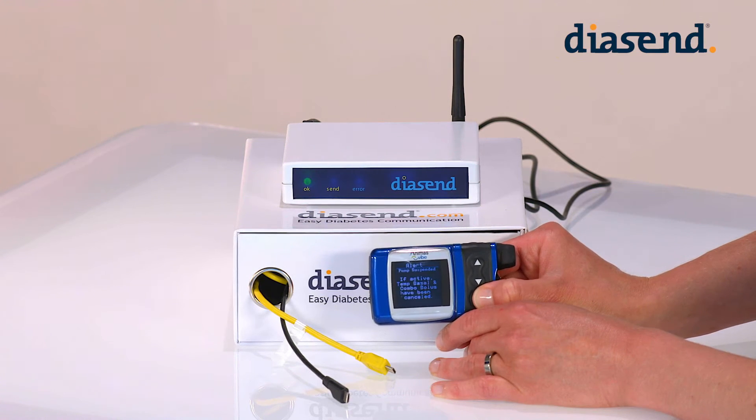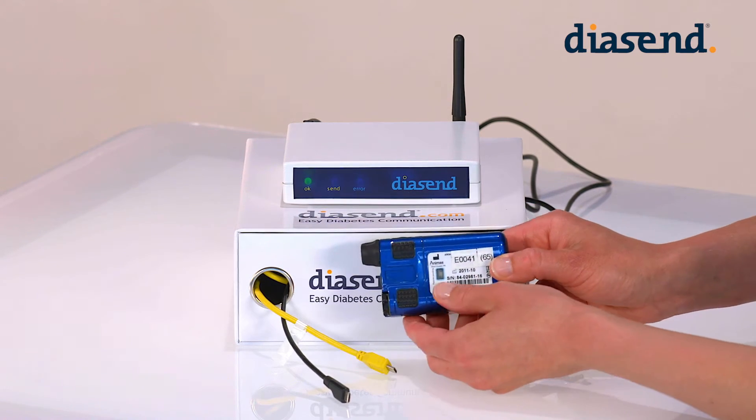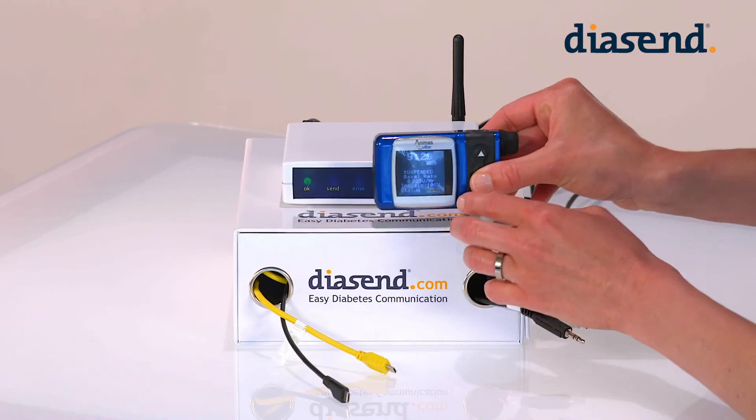The Animas pump has a small infrared eye on the back of the pump. It is this small window that needs to be placed facing the infrared eye of the transmitter, like this.